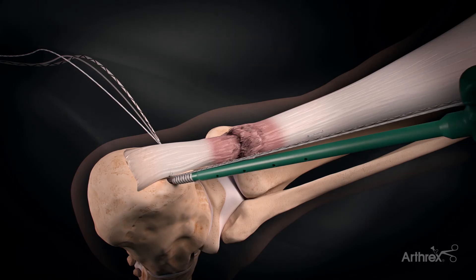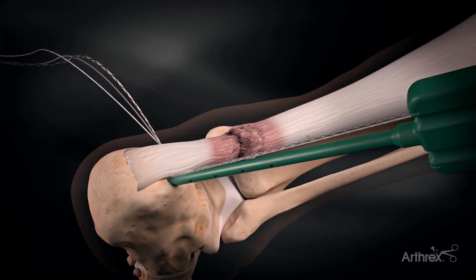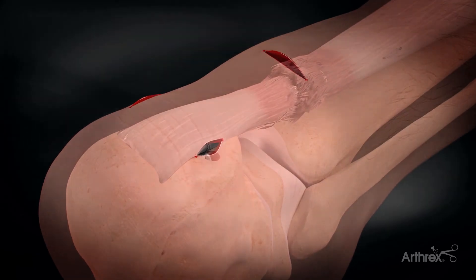Once there is good proximity, we then tack these sutures down with a biotenodesis screw. What's not visualized here is I also use a criss-cross vicryl stitch to repair the stump directly to give it more reinforcement.